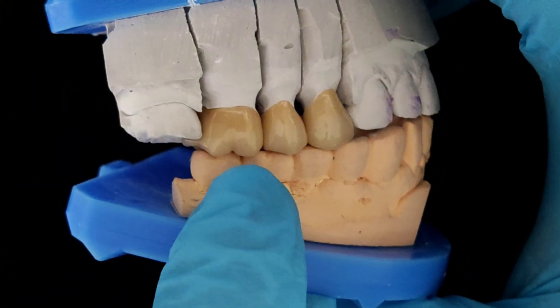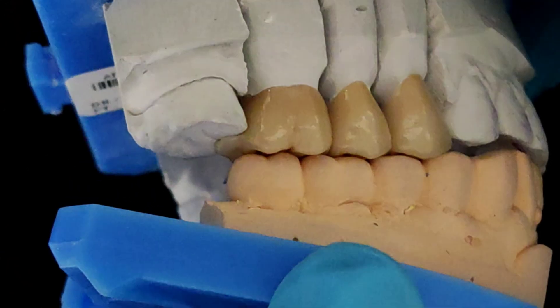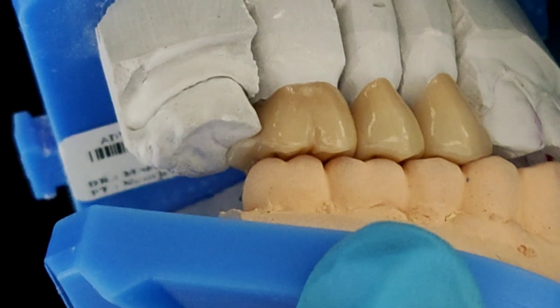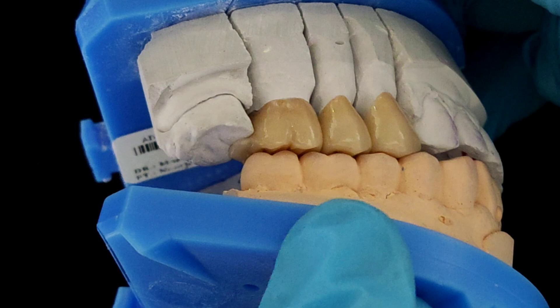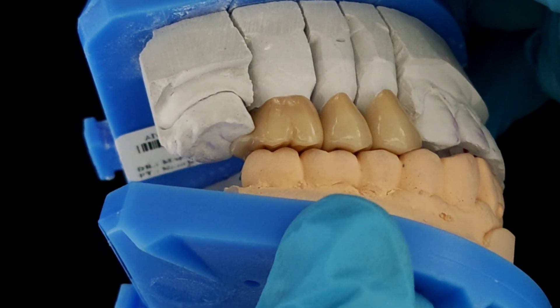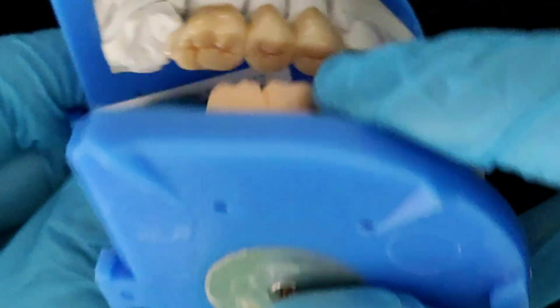The upper six has a good antagonist contact. What I have done is created a small extension in the restoration, almost like a rest, that goes onto the occlusal surface of the upper seven, thereby ensuring that the tooth does not supra-erupt.